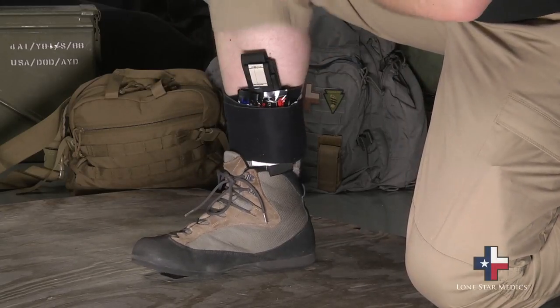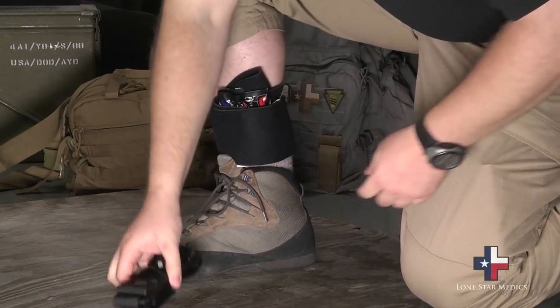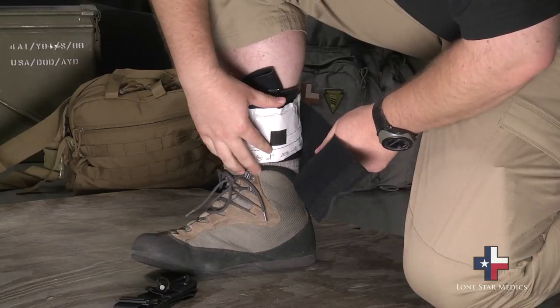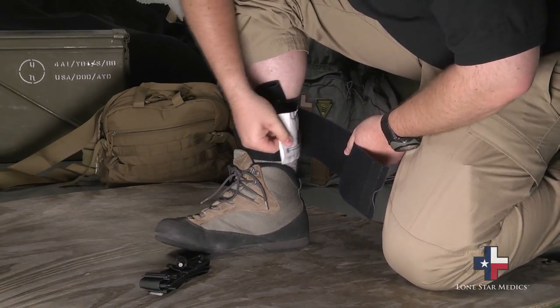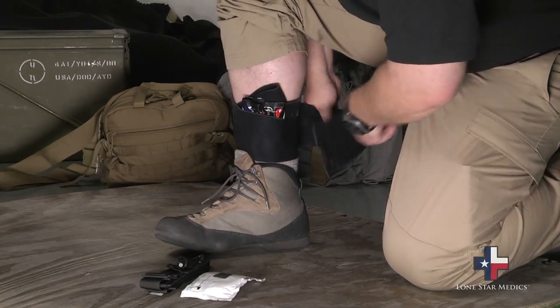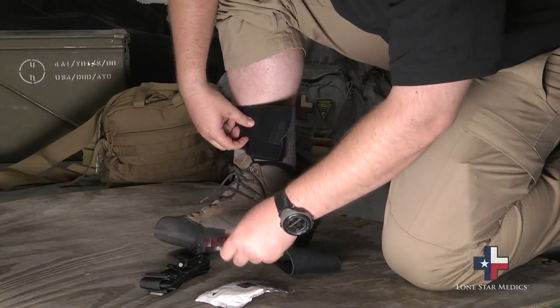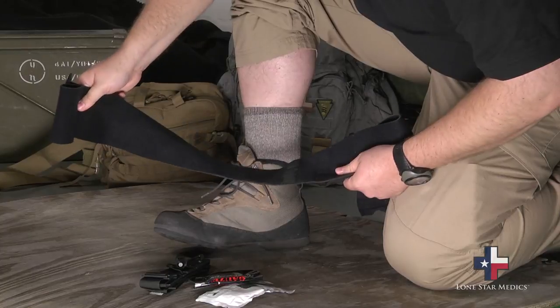So let's look at how we deploy it. First thing we do is hike up that pant leg and get it out of the way. We can grab our tourniquet, pull it out, and deploy and apply it as needed. As we undo the ankle wrap, you'll notice these pieces of Velcro keep those pieces from flying across the room. We've got our hemostatic agent, and don't forget the wrap itself doubles as your pressure dressing.